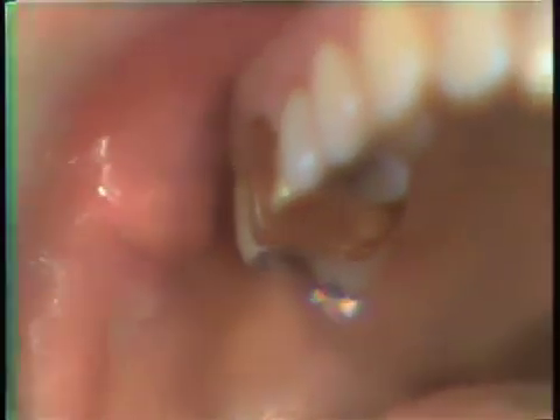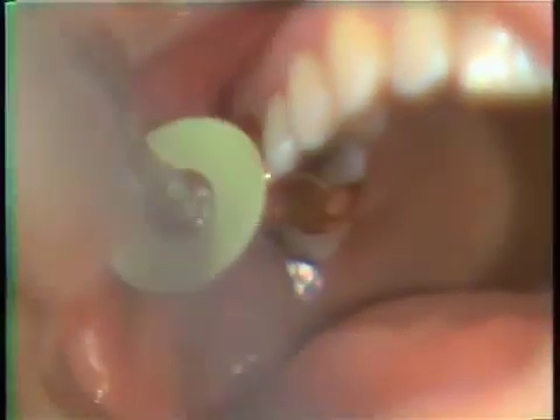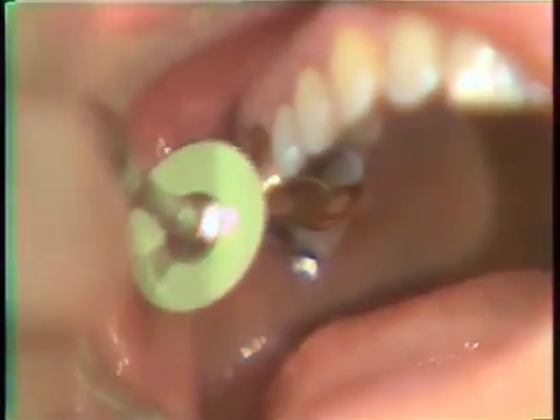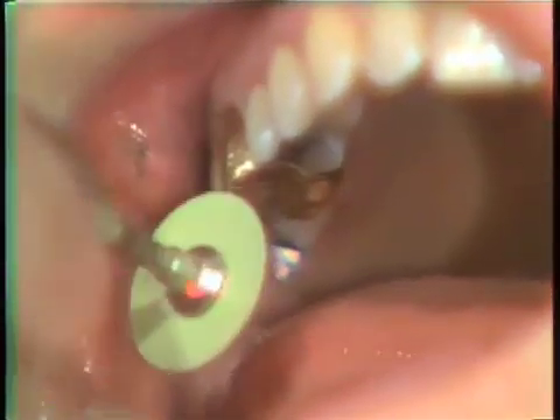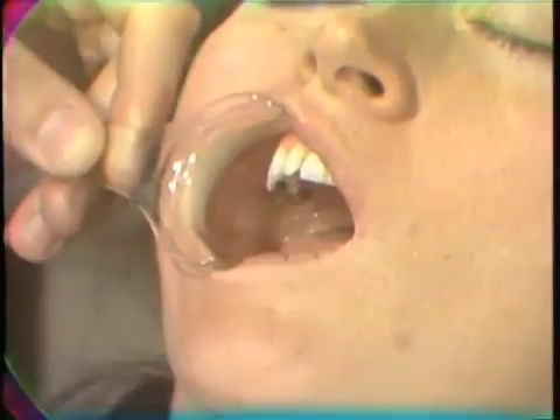It is possible to address this very simply with the use of a fine sand disc, which would just take a little bit of that reflective character off the casting. An effort is made to be sure that the gold has been slightly dulled and will not be an aesthetic compromise during smiling.